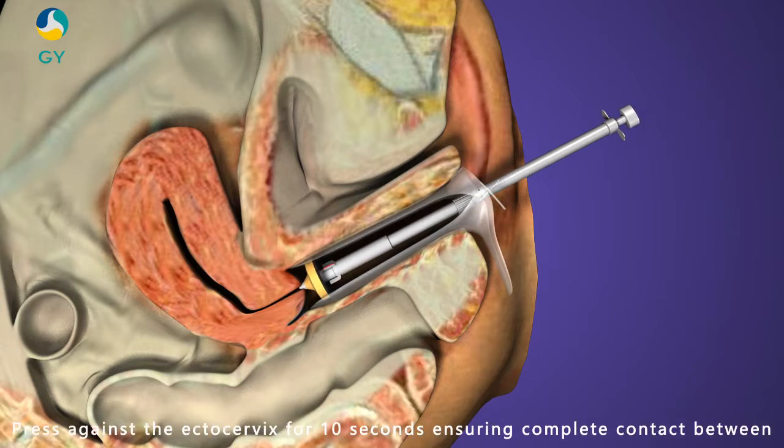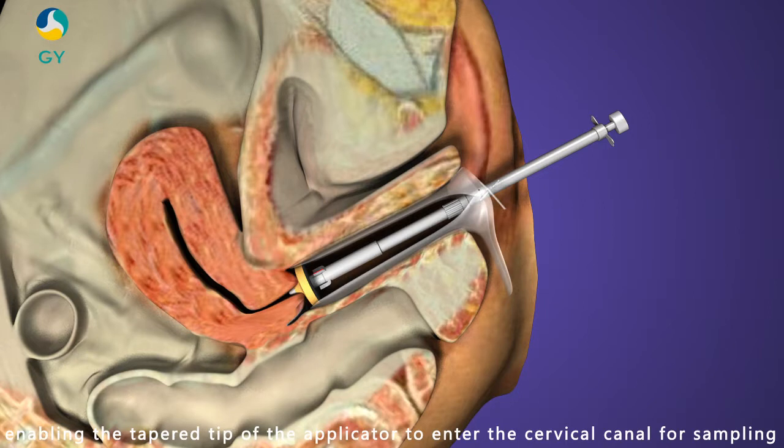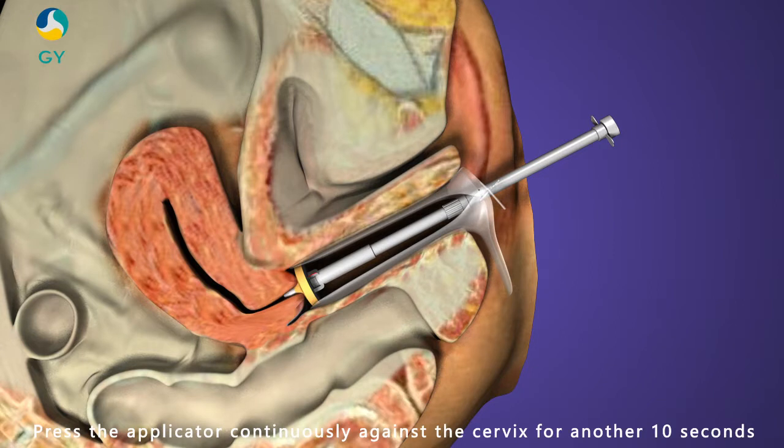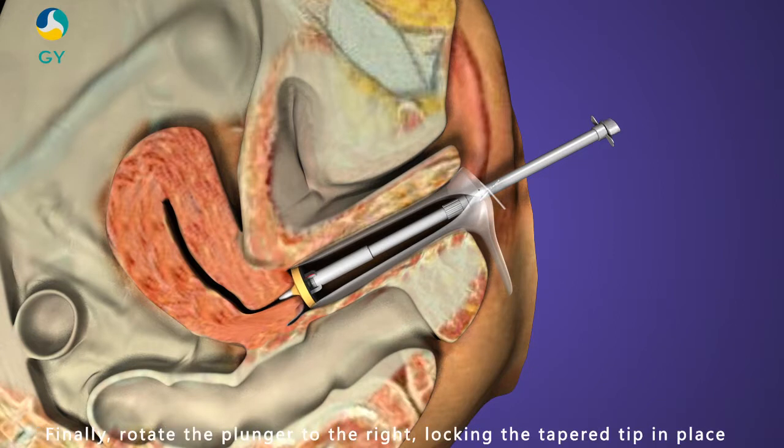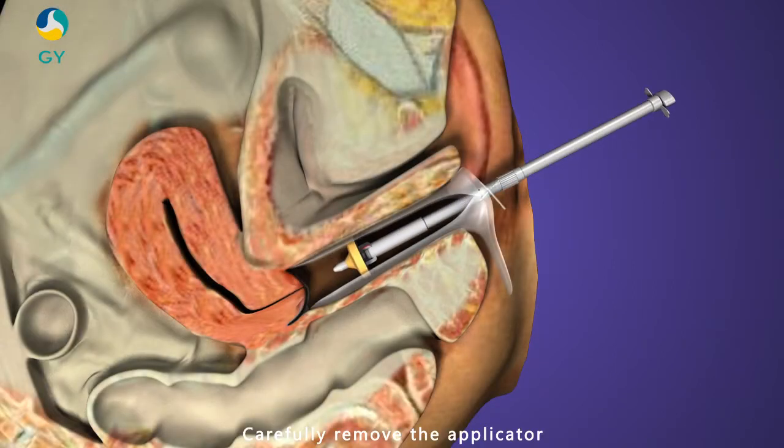Press against the ectocervix for 10 seconds, ensuring complete contact between the ectocervix and the polyurethane foam. Next, push the plunger labeled with the letters FRD, enabling the tapered tip of the applicator to enter the cervical canal for sampling. Press the applicator continuously against the cervix for another 10 seconds. Finally, rotate the plunger to the right, locking the tapered tip in place. Press the applicator against the cervix for 5 more seconds. Carefully remove the applicator.